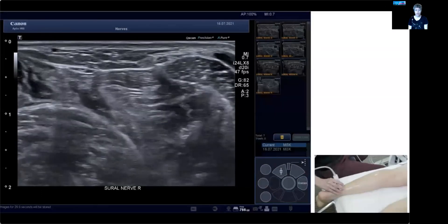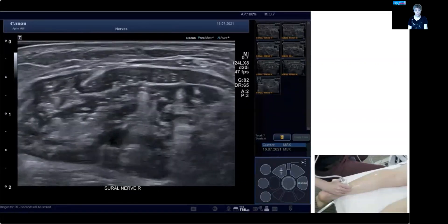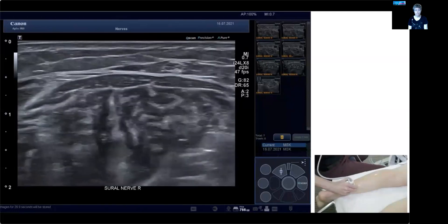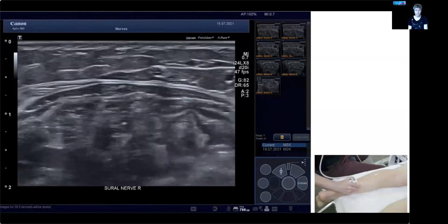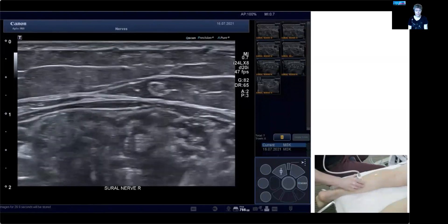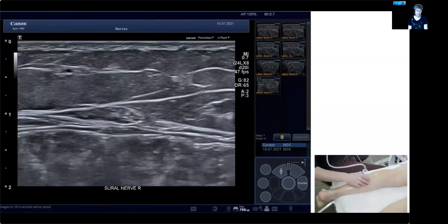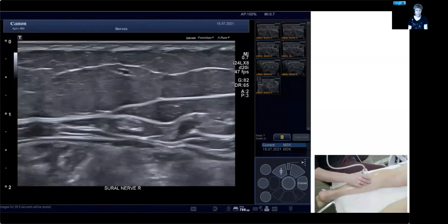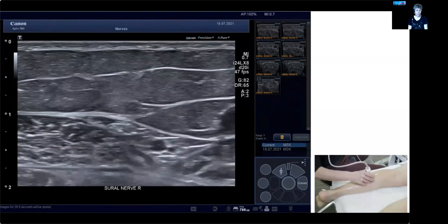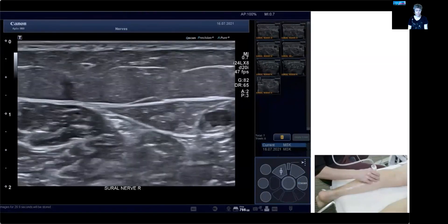Finally, we're going to follow the nerve from the ankle region back up to the knee fold, scanning over the calf and the fascial sheathing of the calf muscles. It's in that deep layer of the subcutaneous tissue — there will be a vein somewhere in the vicinity. You can track this nerve back up all the way. The subcutaneous region is getting a little larger, and here's the gastrocnemius muscle coming into view. The nerve is still there, right on top of it, next to the vein.